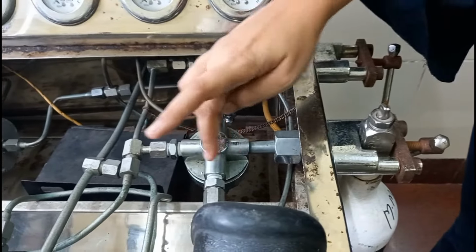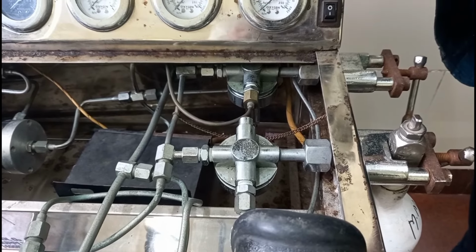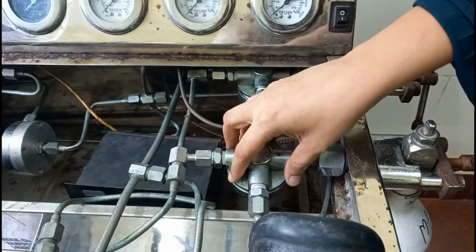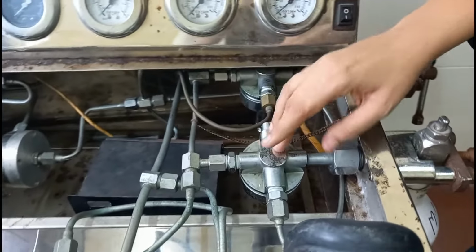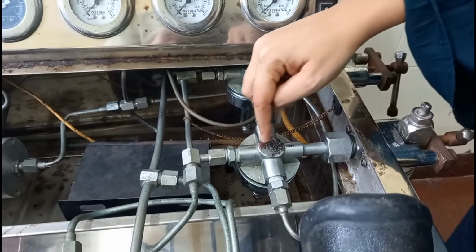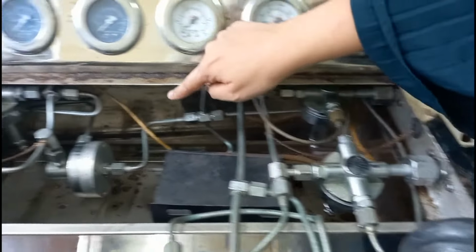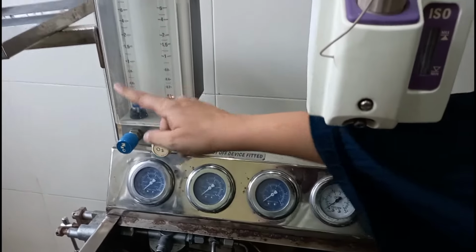Now this is a pressure reducing valve that will reduce 2000 psig of oxygen or 760 psig of nitrous to 45 to 50 psig. This is the pressure regulator which is going to reduce it, the pressure reducing valve. And how much pressure there is will be told by these gauges. Okay. Now from here the gas enters from the pressure regulator, and from here it goes to the flow meters. Here these are the flow meters. These flow meters will have nitrous and oxygen.